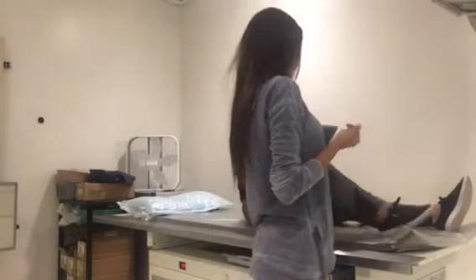And my central ray is going to come in at the patellofemoral joint.